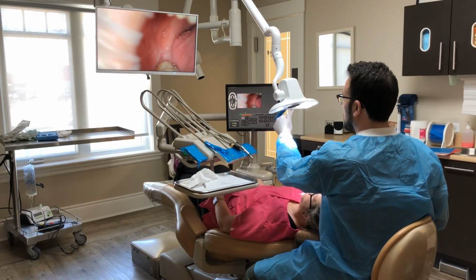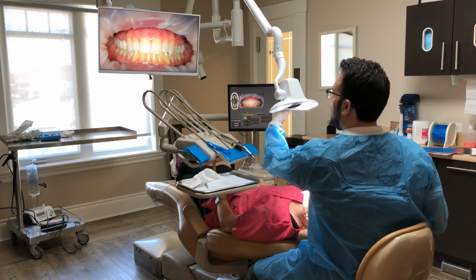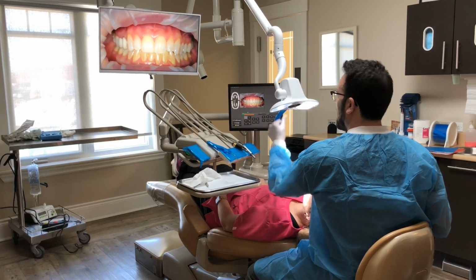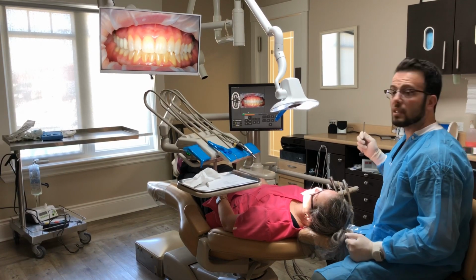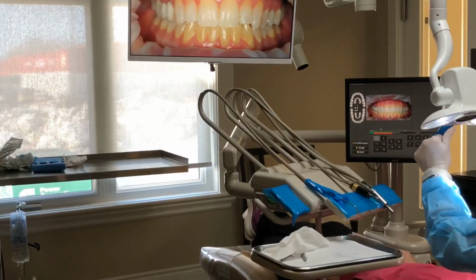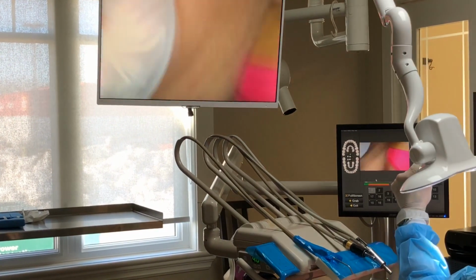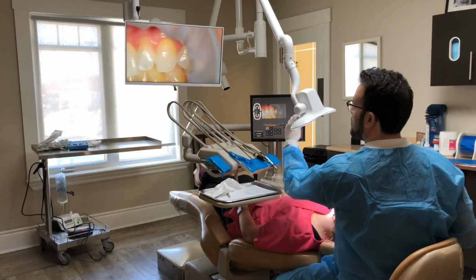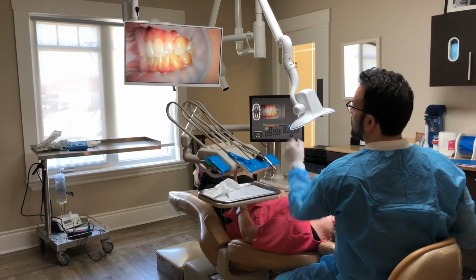Now, let's take a look for extraoral photos. You can bite down, and you can see how quick it is to take any extraoral photo, and again, without taking the big lens camera, instant photo with it, show it on the screen, instantly in the patient file, very practical. Turn to the right. I can record different positions like that just by moving the ELIO around and asking the patient to move. I can zoom in, and all done with touchless controls.